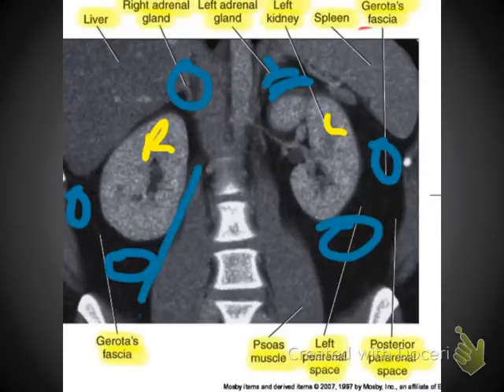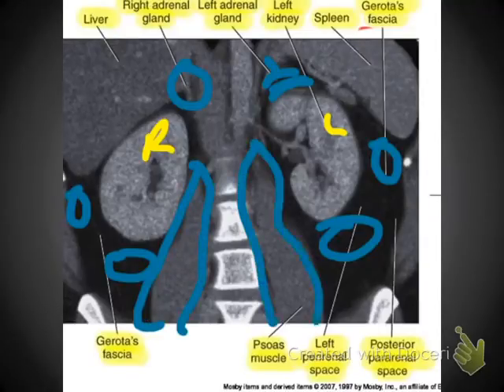Also, we have the psoas muscles running here, which in coronal we get a better indication of where the ureters are in relationship to the psoas muscles, because we can see the proximity as we're scrolling through the images. But for pretty much this image, just know each and every one of these bullet points, as it'll help you paint an overall picture of the abdomen.